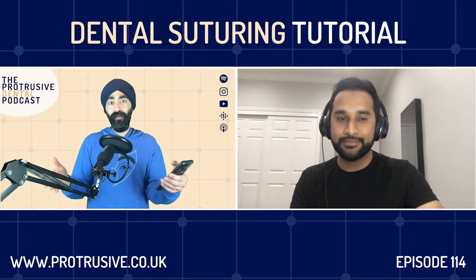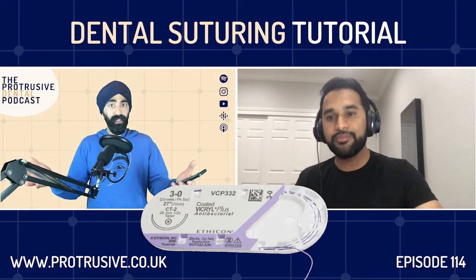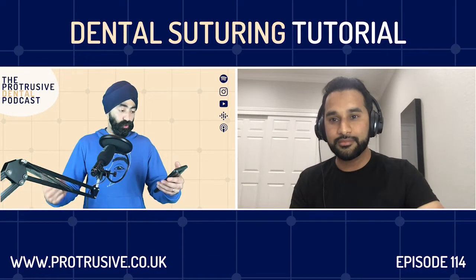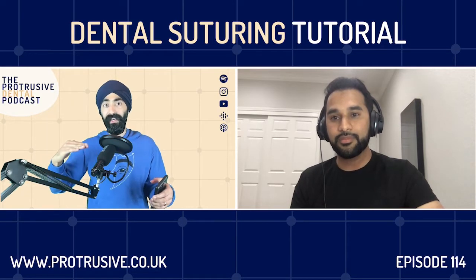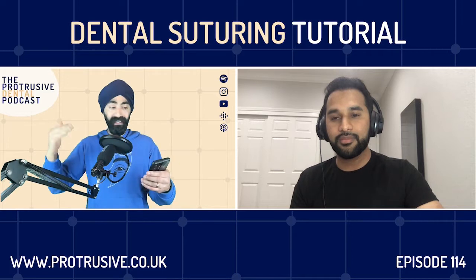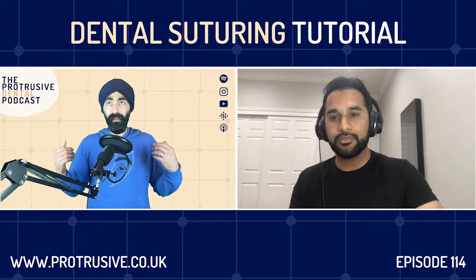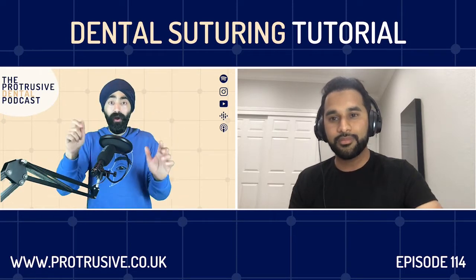I was taught Vicryl. Now, Vicryl is a brand, right? It's a PGA. It's polyglycolic acid, right? So that was the first suture that was taught to us as students, and the sizes, which I think will really go back to basics. Just explain a moment about sizes and what it actually means for the newbie dentist listening. And that's the first sort of suture that we learned. Is that the universal suture? If you only had one, would it be that one?